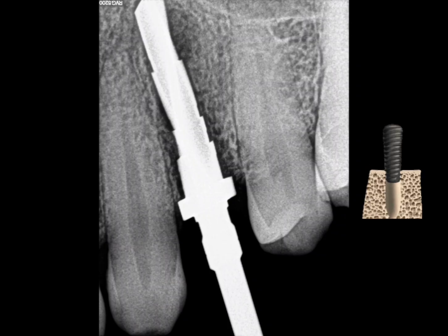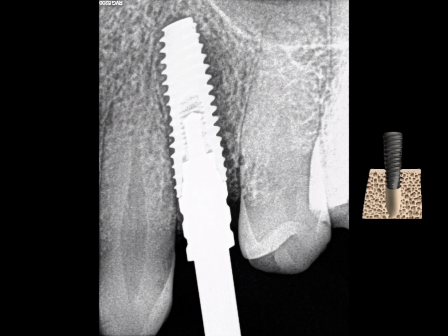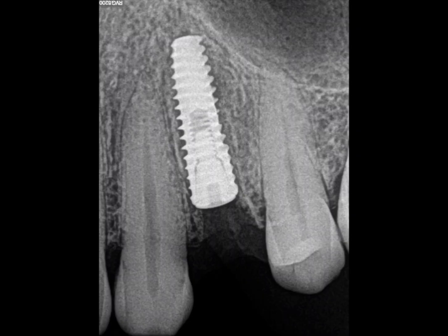Osteotomy preparation was then carried out while maintaining ideal three-dimensional implant positioning. A 4x13 mm implant was placed. Primary stability was achieved with satisfactory insertion torque, making immediate implant placement possible.